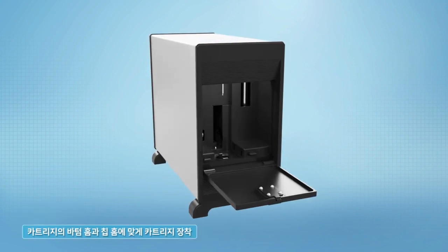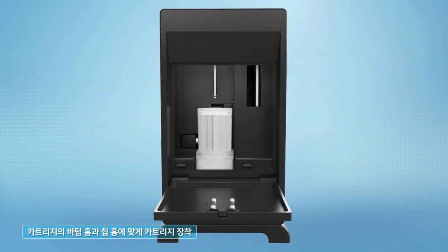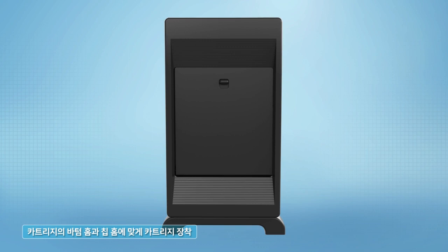Open the LabGenius door and fit the cartridge into the bottom chip groove. After installing the cartridge, be sure to close the LabGenius door to shut out external light.